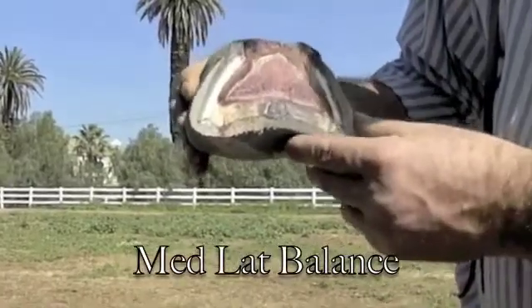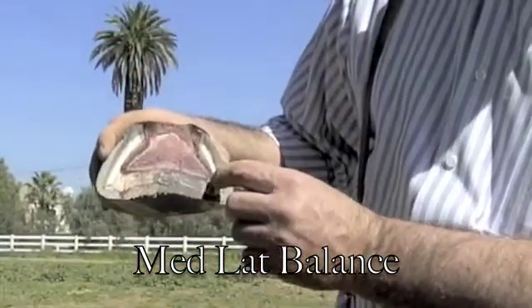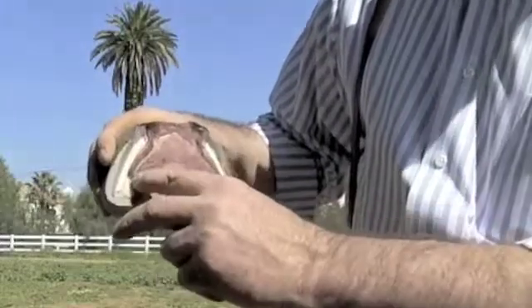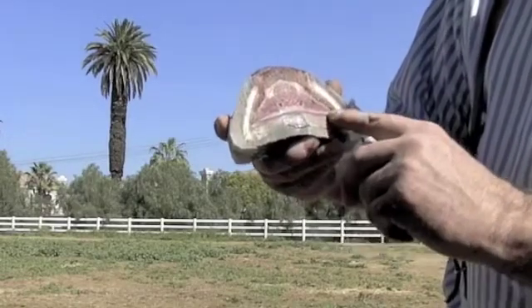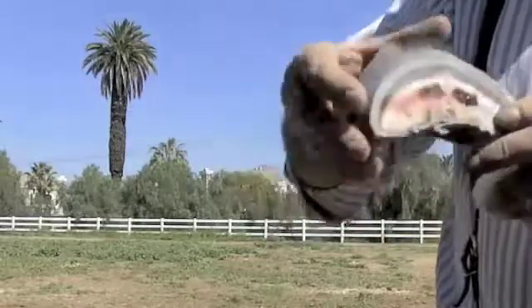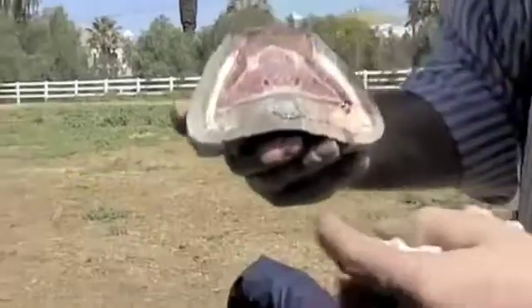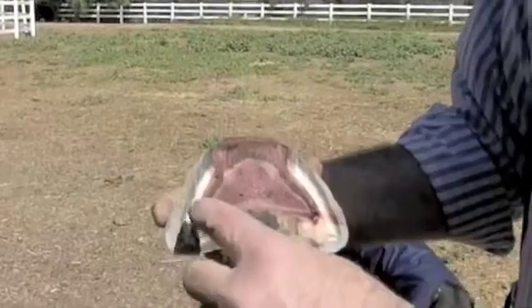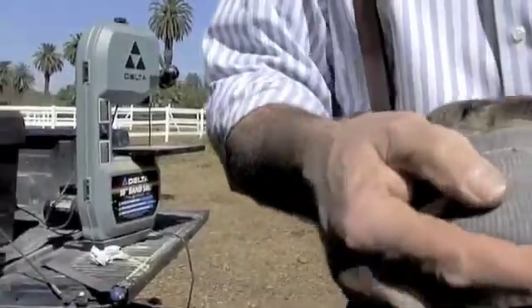This cut clearly shows the difference in distance from one side to the other. By adding that lateral extension we're going to bring the foot more into harmony. Right now you've got much more of the foot going one way — higher here, lower there. There's your frog, there's one wall, here's the other wall. When we look at where we added the wall, you can see how similar the distances become from the center of the frog — much closer than before.